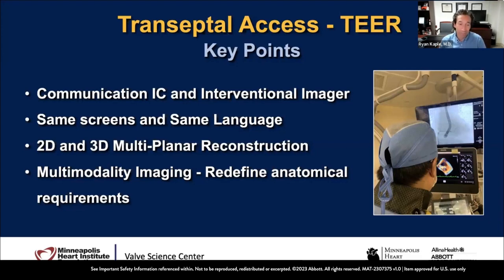It's kind of my opinion. We do have more imagers doing the pre-screening, but we do have one imager doing the actual procedures. That's right. And also, the imager who does the procedure can also spread the knowledge. I think the other echocardiographers doing the TEE screening can also make sure that they get the necessary views and the 3D so that it helps in the decision making.